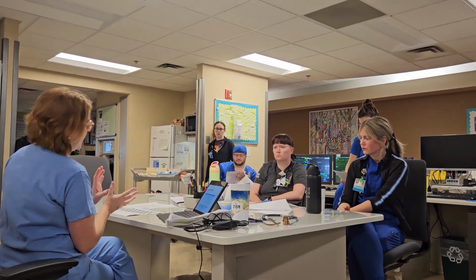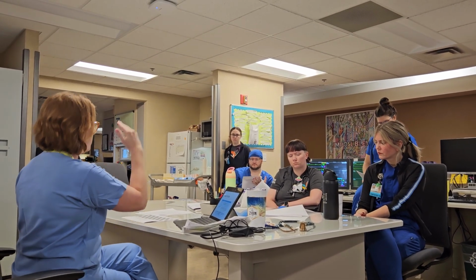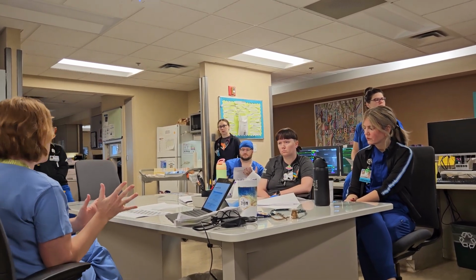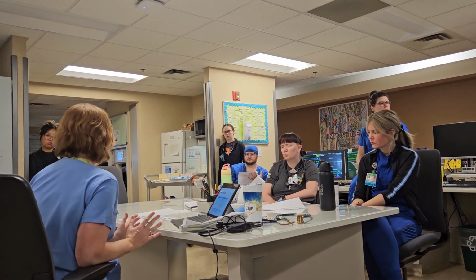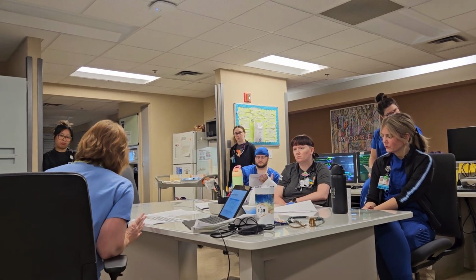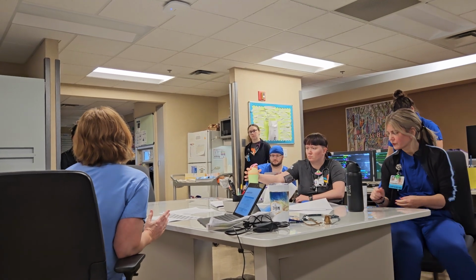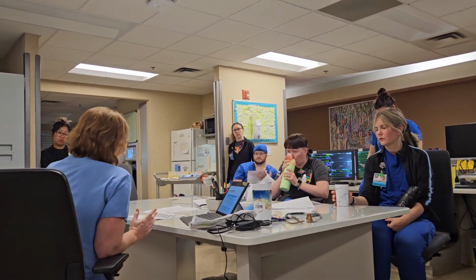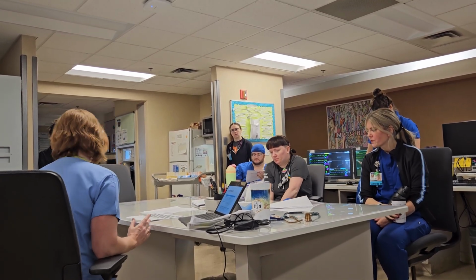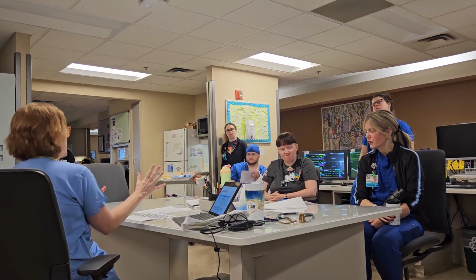BiPAP, on the other hand, is a bi-level positive airway pressure. So it adjusts the pressure based on inspiration versus expiration. It very much mimics what assist control can do. It's best for hypercapnic respiratory failure. With the pressure support, with the inspiratory pressure, you can still kind of target a tidal volume that you don't target with CPAP at all. With CPAP, you don't target a tidal volume, you just have a backup rate and an airway pressure. That's it. The patient is responsible for the rest.